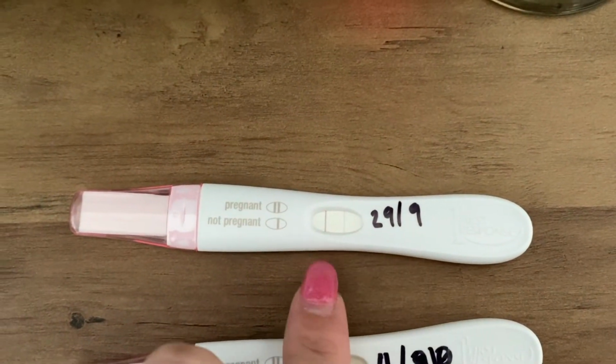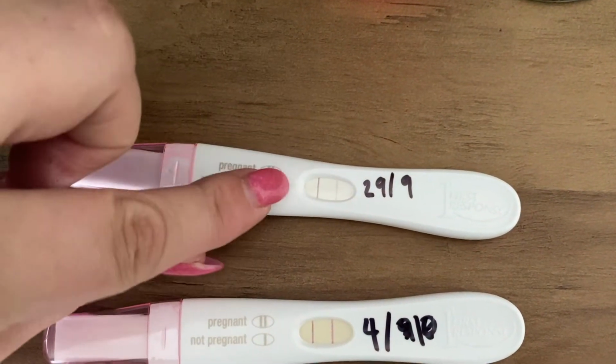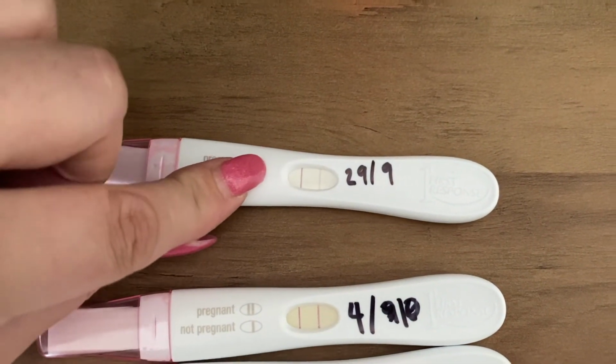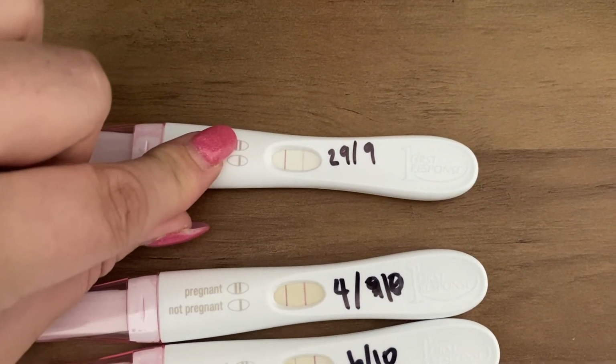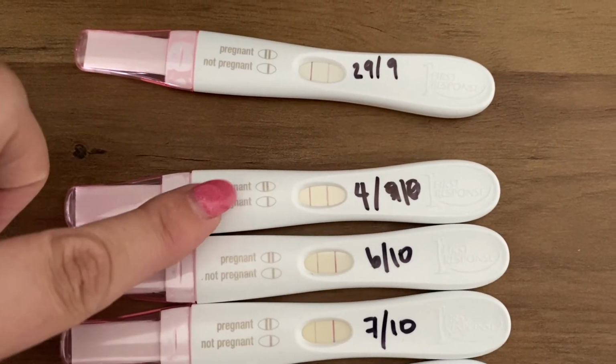We had also decided, after talking to our gynecologist, that rather than me getting tested for my HCG every week, I would do pregnancy tests and just watch my line get lighter. So I will show you guys those. Right up at the top here is the one we took before I actually had the D&C. On this side is the control line, on this side is the test line. So you can see that it is a lot darker than the control line, and that's because there was still remaining product in there. And if you look down, this is 2 days past my operation.